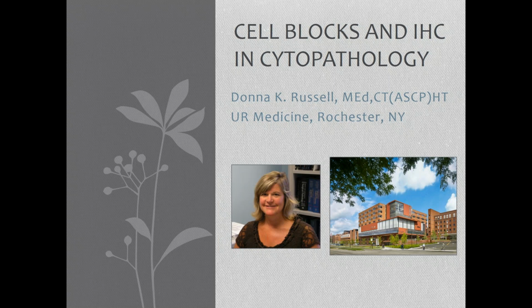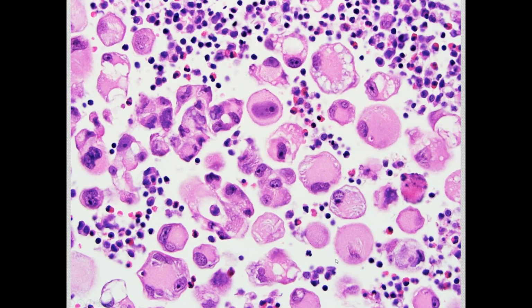Barkan, and I'd also like to thank the ASC leadership and staff members for the opportunity to present cell block and IHC in cytopathology. The cell block offers many advantages over other cytology preparations, particularly for immunohistochemical stains and molecular testing. There has been an increased demand to obtain material for diagnostic, prognostic, and predictive purposes for cancer patients. Cell blocks of good quality and cellularity are essential for these purposes.